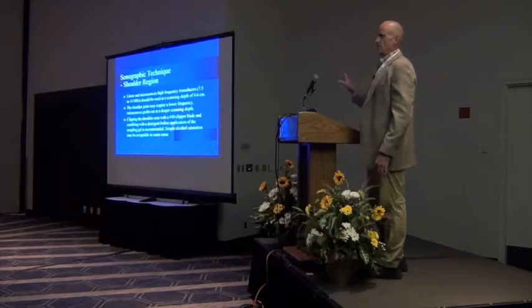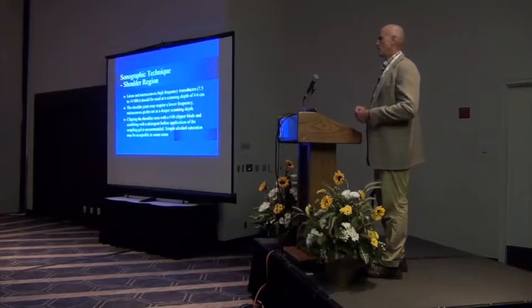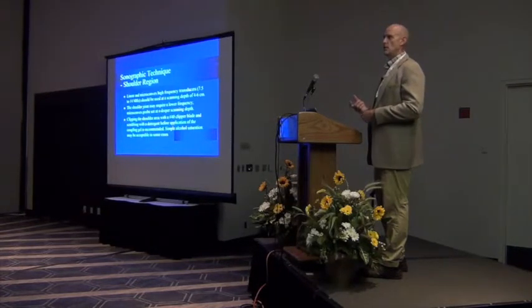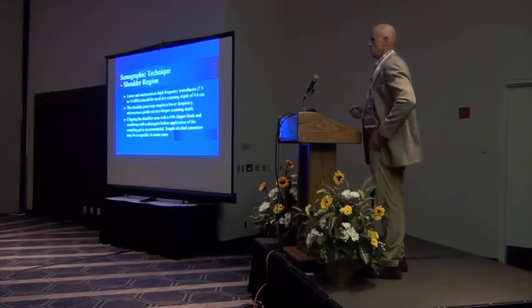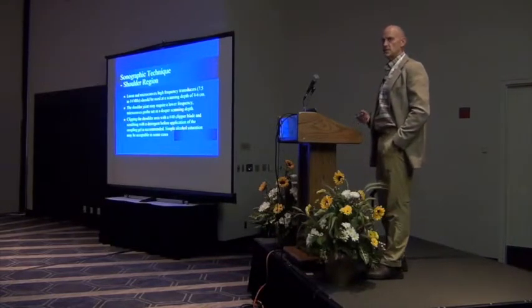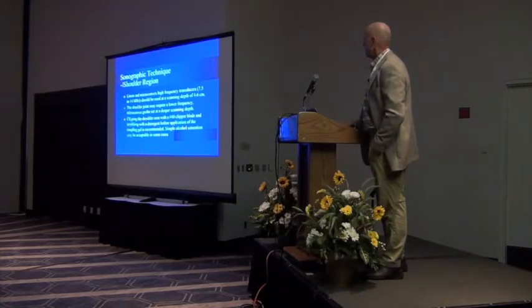And I always talk about clipping. If you've got a horse in the show season, it's the middle of summer, you don't necessarily have to clip them. A lot of people will use alcohol. We used to say in the old days not to use alcohol because it would denature the rubber in the probes. That's not seemingly enough of a problem, but I would talk to whoever you bought your ultrasound system from just to make sure that that's not an issue. I do a lot of lubes and stay away from alcohol except when I'm doing interventional procedures, and then I will use alcohol. And we'll talk a little bit about that potentially as we go along.